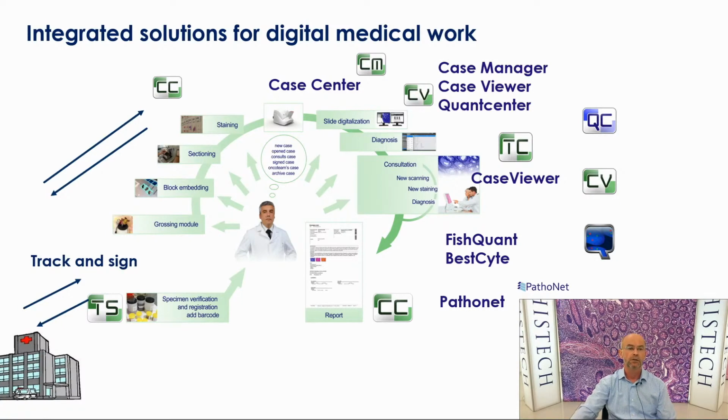The pathology is getting integrated from the smaller pathology service laboratories who collected specimens from the nearby ambulances, outpatient departments. Also today, big institutions with several thousand slides per day are emerging.